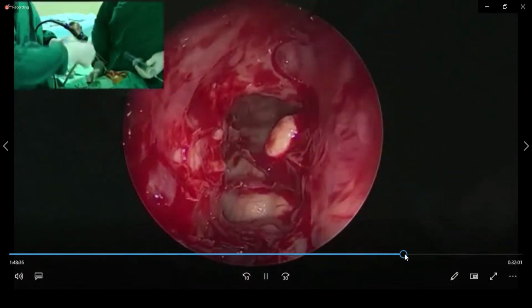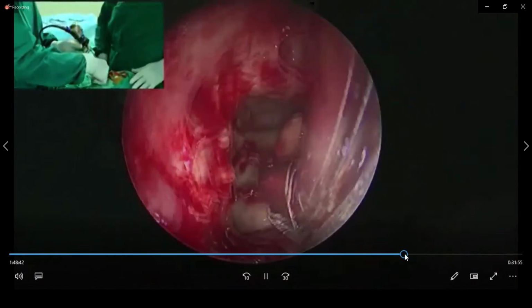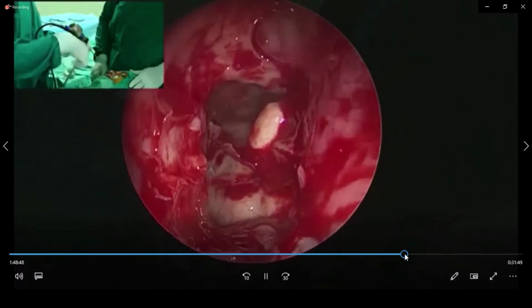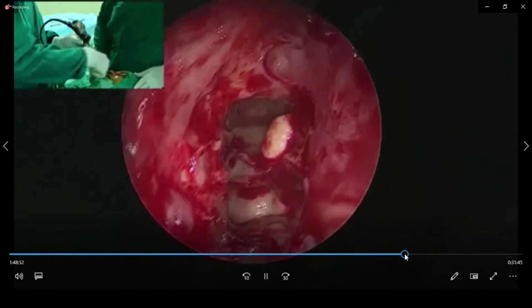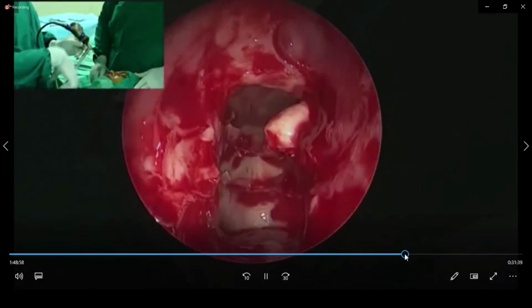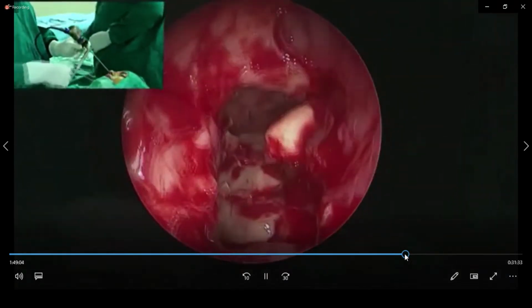Once we remove the party wall completely, you can imagine how big the frontal sinus drainage is going to be here. This is such an interesting frontal sinus. You have seen big agger nasi, you have seen big type 3, you have seen supraorbital cell, supraorbital recess, and an osteoma on that. So completely narrowing all these things together, frontal recess.